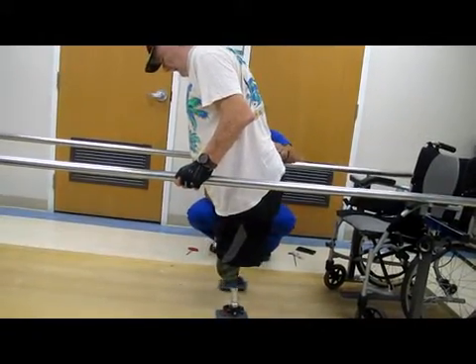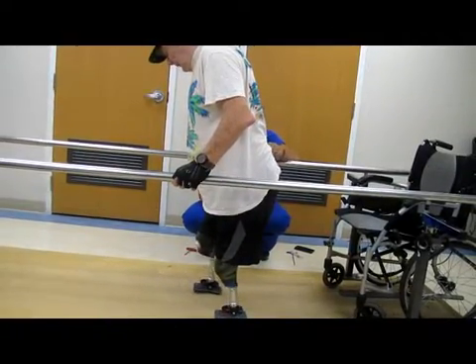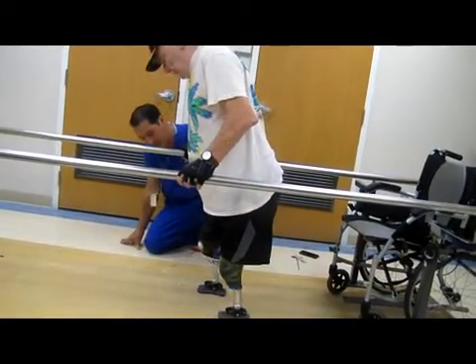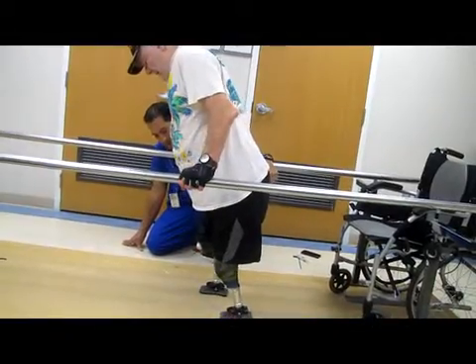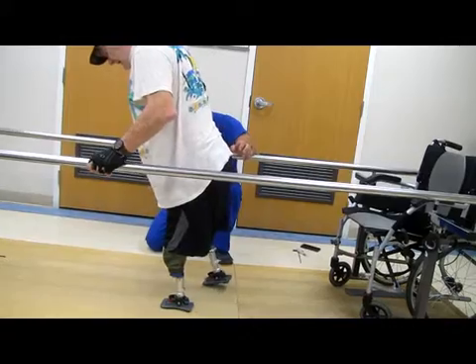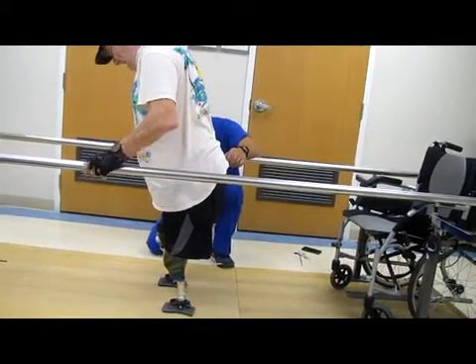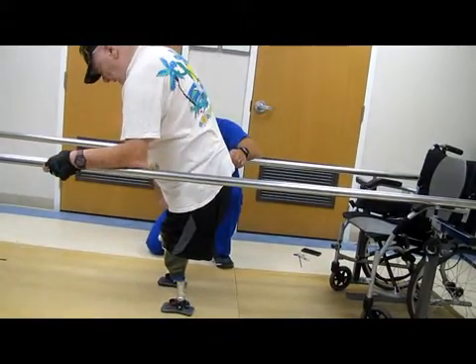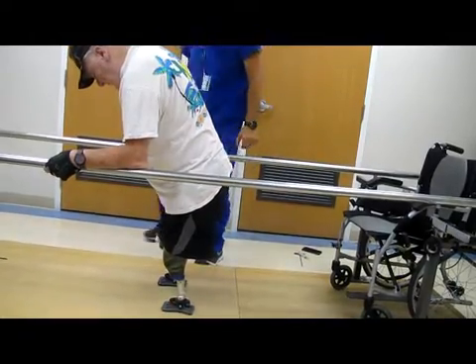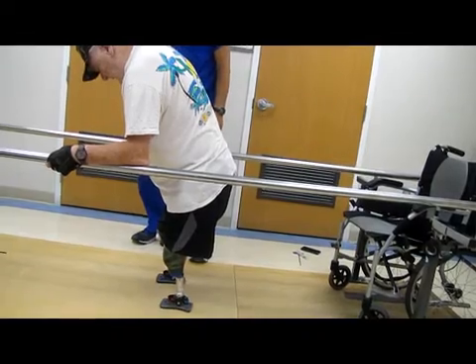See, I can really do it quite easily if I put my weight on the left one and swing this over. But the opposite, transferring the weight to the right one, is because it's a bit painful and it feels extremely odd right now. But then I've got 3-4 things going against me, one of which is I haven't walked in 5 months. Yeah, exactly. Would it help to have a pad added on the right side for comfort, you think?